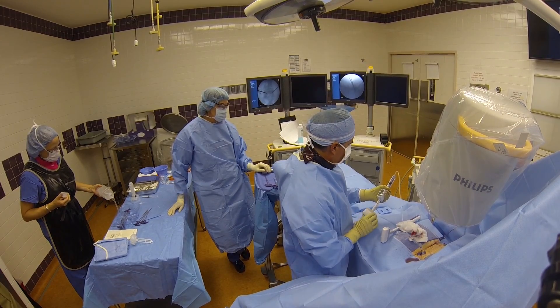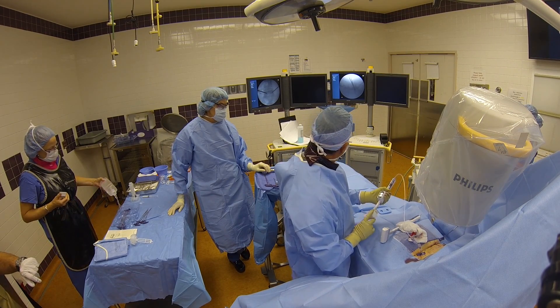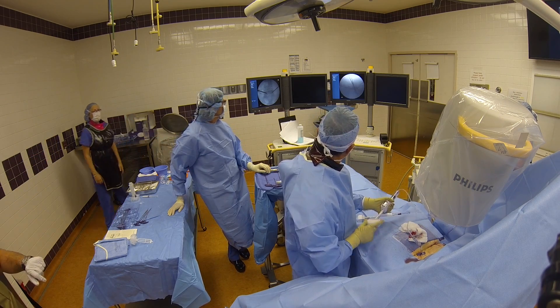The next step is to use a small drill to create a channel into which I will place the deflated balloons. Notice how I am constantly checking the x-ray machines to make sure that I am safe.